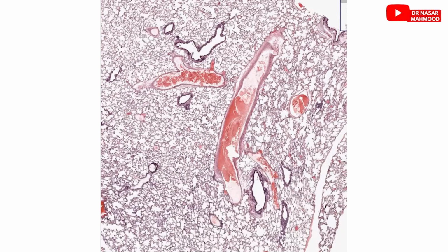Now, that's the classic histological structure of the lung, an organ specialized for efficient gas exchange between air and blood. Now let's move on to the next slide.